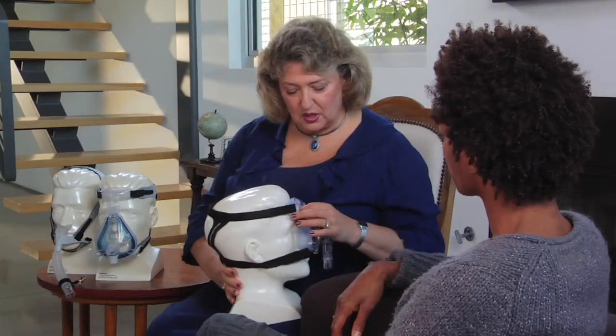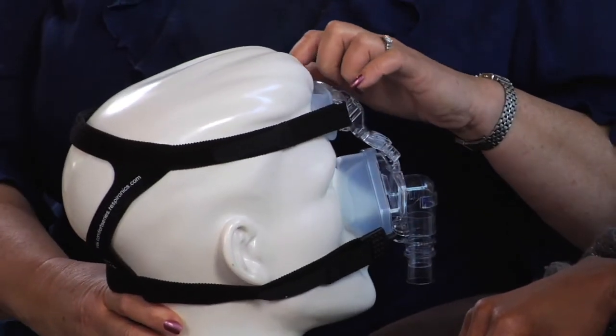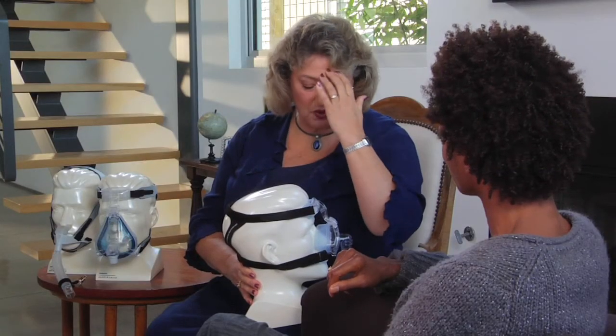And this really addresses your complaint very well. It has a redesigned forehead pad that goes straight across your forehead. It's nice and puffy so it doesn't put undue pressure on your forehead and is less likely to leave any creases.